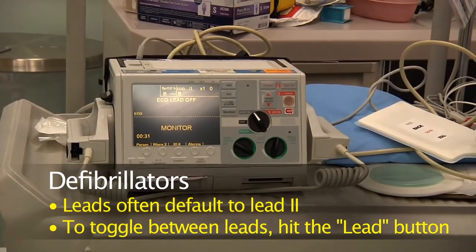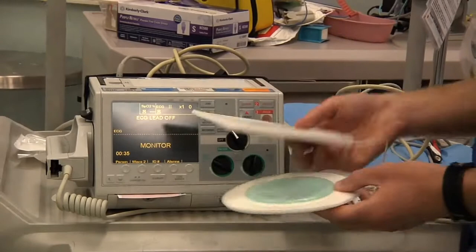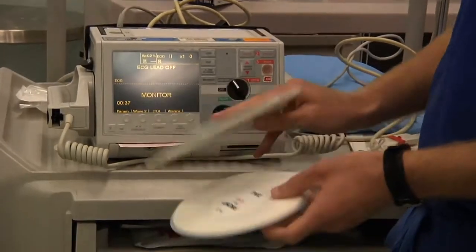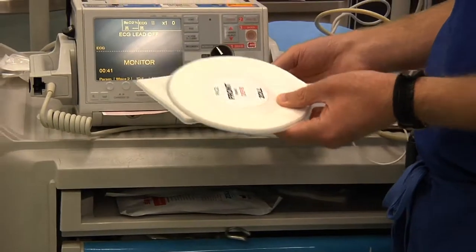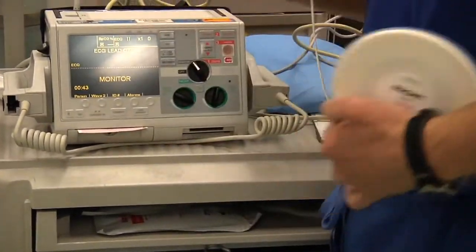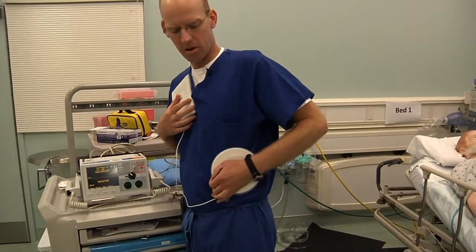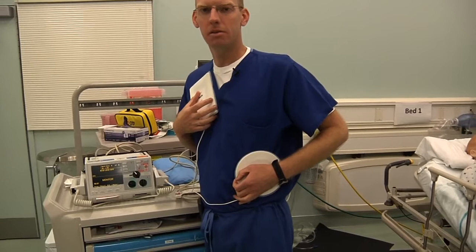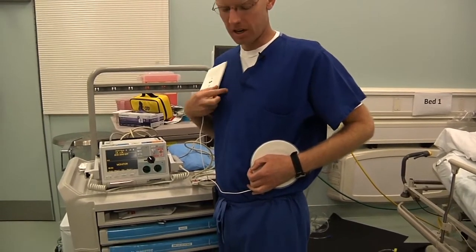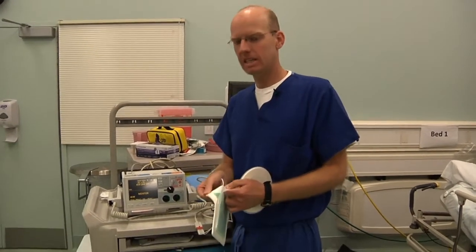Now, if you're using it in a code setting, you're going to use what's called the quick combo pads. These are the pads that are placed either anterior, posterior, or on the upper right sternal border and left chest wall for defibrillation and pacing. The idea is you want to get the energy delivered across the ventricle. So it's either like this or like this. They're peel pads and they stick on.